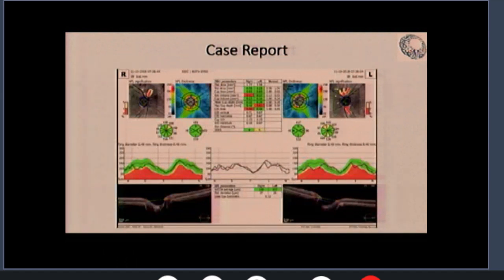Regarding the OCT, I didn't ask about this OCT. The left eye shows superior and inferior nerve fiber layer thinning, which is suggestive of early glaucomatous changes in this eye. Yes, there are two important signs to talk about in this case. One, the difference between the pressures. The right eye has 16, the other one has 21.